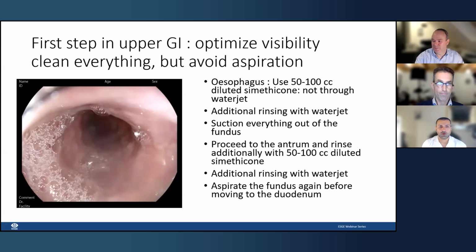One comment on that, if I may, on Raf's excellent presentation, is that, as Bas said, there's also pathology in the mouth, and it's really important that as soon as the endoscope enters the bite block, you look at the oropharynx as well. I've diagnosed early squamous cell cancers of the hard palate in patients. So your point is well made, always inspect the oral cavity if you can, and that's where sedation comes in. Sorry to interrupt, but that's a good point.